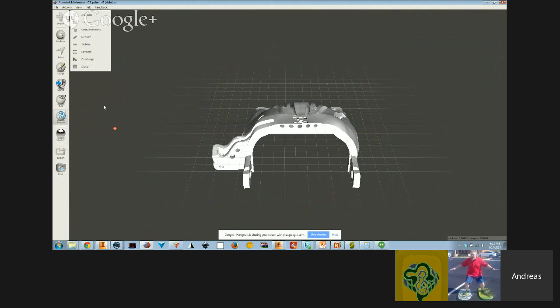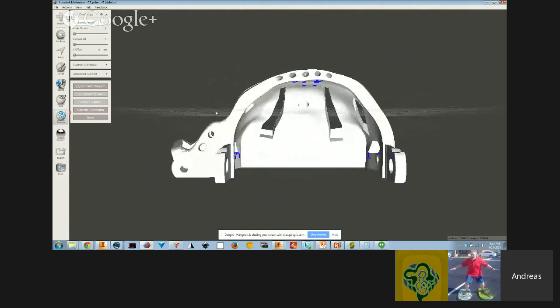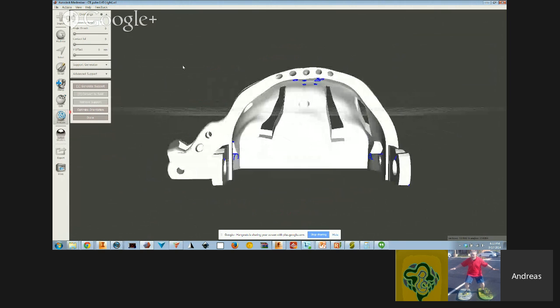So I'm good there. I'm going to go into the analysis bucket and choose overhangs. This is where I'm going to be able to set up my support structures for this model. Okay, so here I'm going to just choose, let's do Replicator 3mm defaults. I have a list of defaults here, and we're going to add to these with more releases. Basically, this kind of sets up.